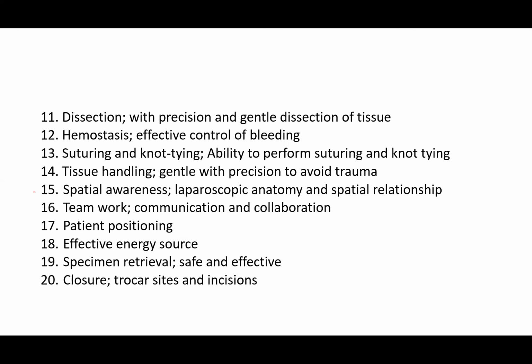Now, spatial awareness. You should be able to correlate the spatial awareness of what you are seeing on the monitor with the patient you are operating on.